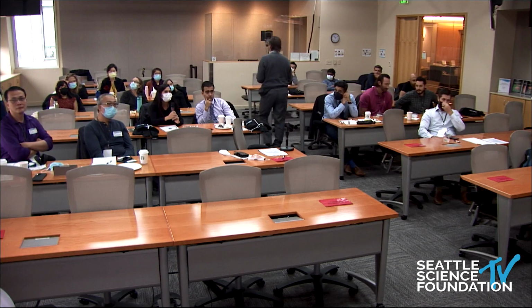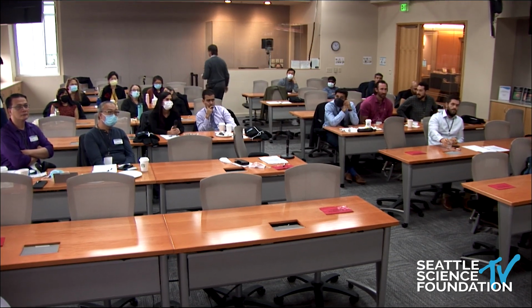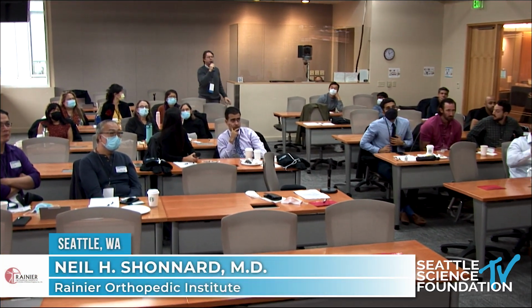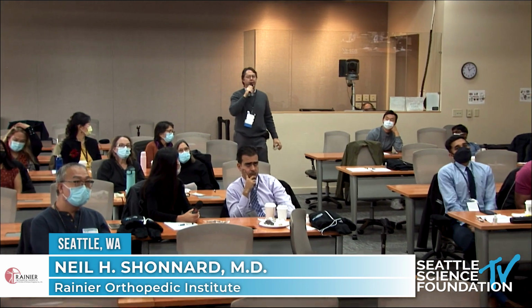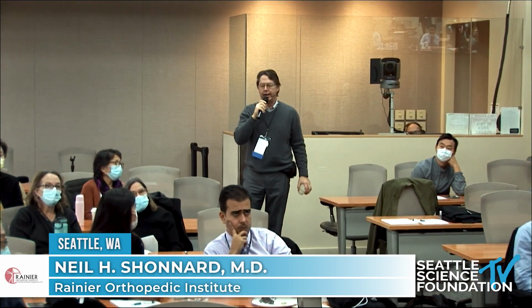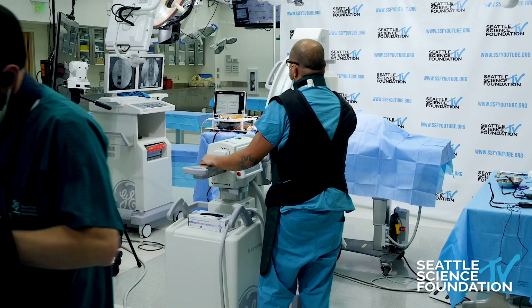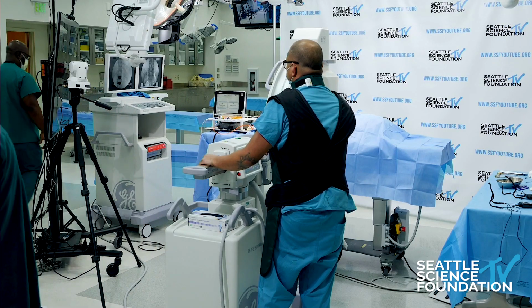So, Doug, did you hear that question? Doug, the question was retropulsion. How do you evaluate retropulsion, and how do you make decisions on retropulsion? Well, if their mic is off, I'll answer it.